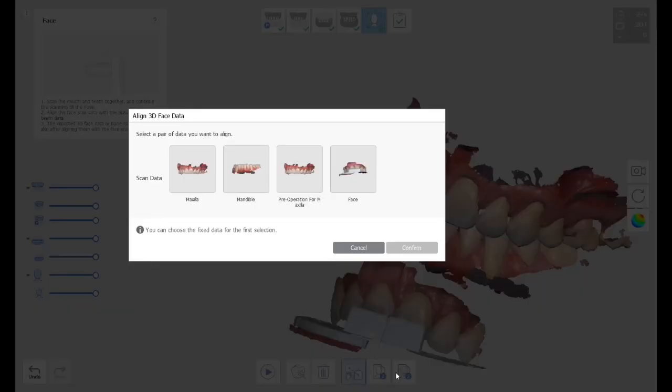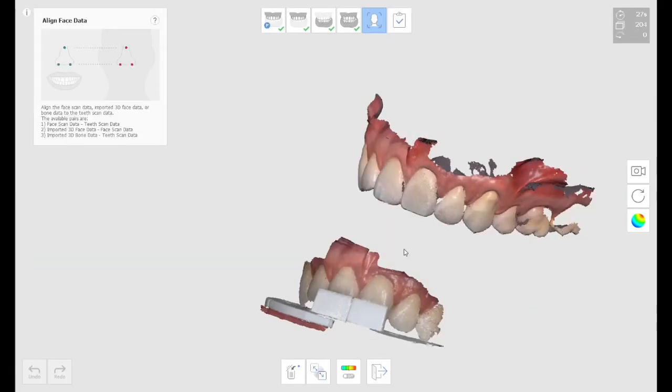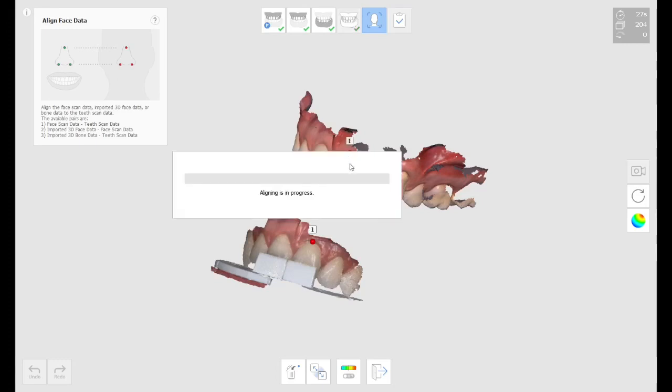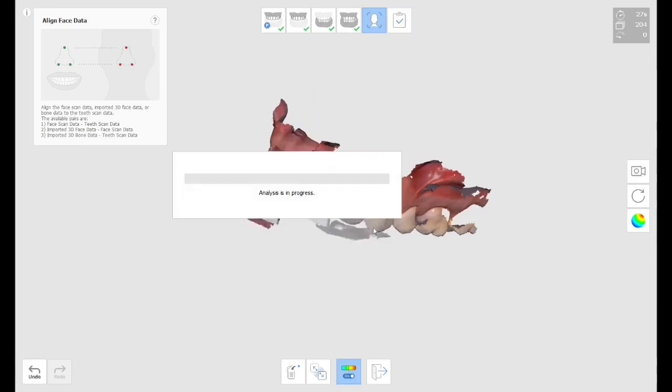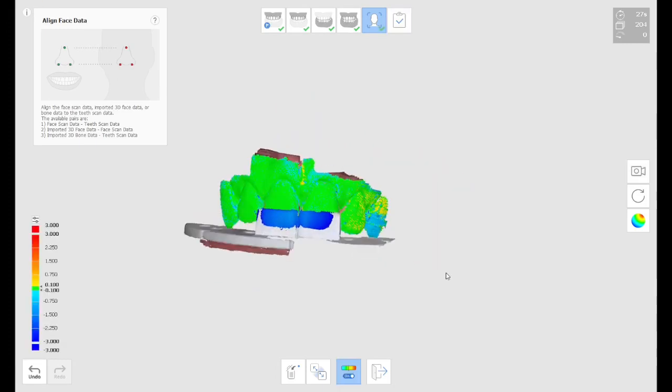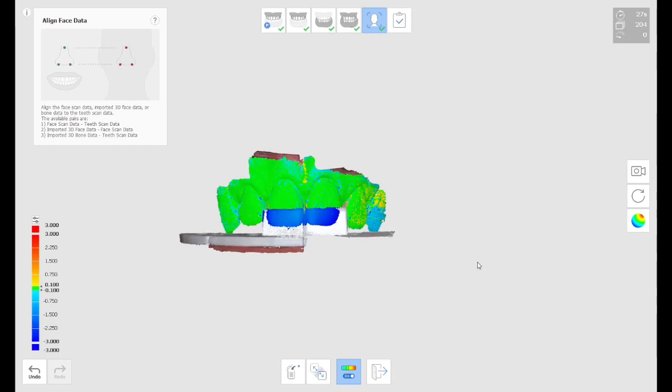So right here, what I'm going to do is I'm going to align the two of them. I'm going to choose the maxilla, I'm going to choose the index tray, choose a common point in between the two, click on the two meshes, and then everything becomes aligned. So that's nice.